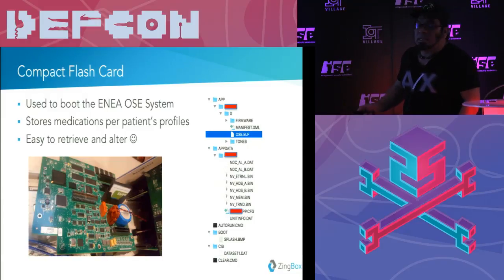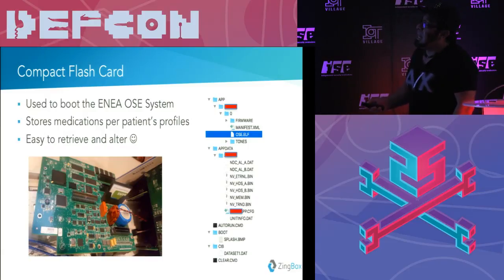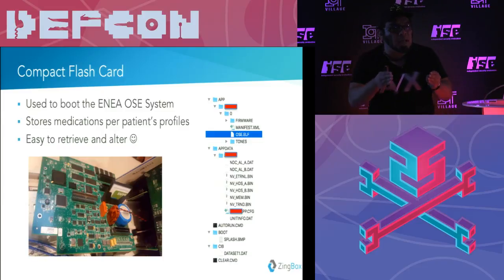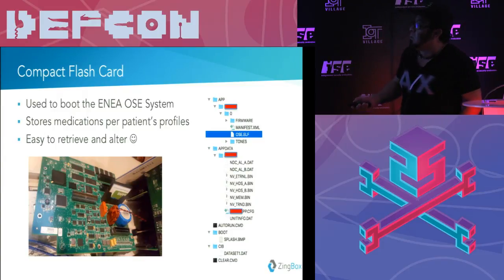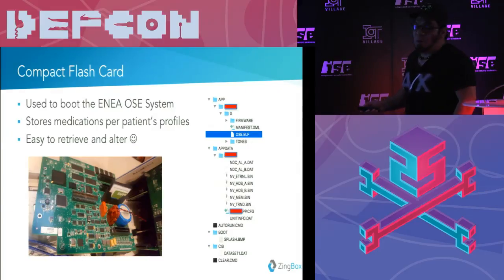And here is some content, obviously some of it I removed. It has some firmware there. Here is the ELF binary that I talked about, the real-time operating system. It comes with the kernel and the application running on it. It's a 7 megabyte file with fully stripped symbols, so you can imagine it's very hard to deal with. Here is more information about the patient profiles, and some information about the configuration of the pump.